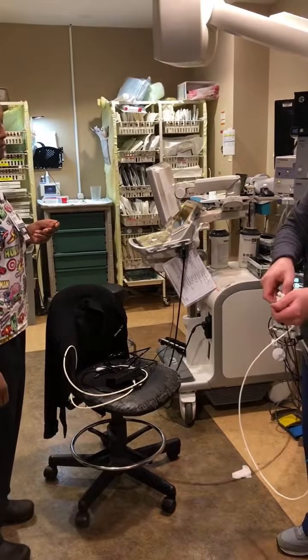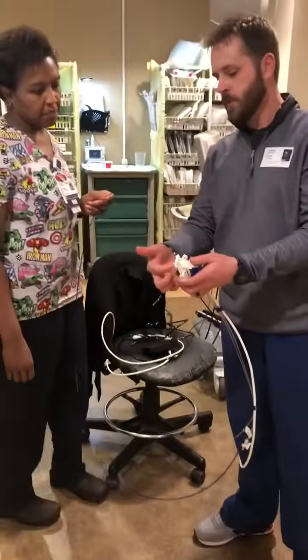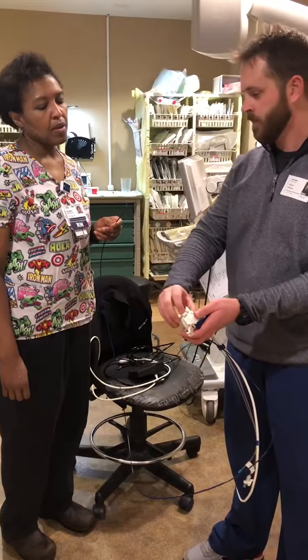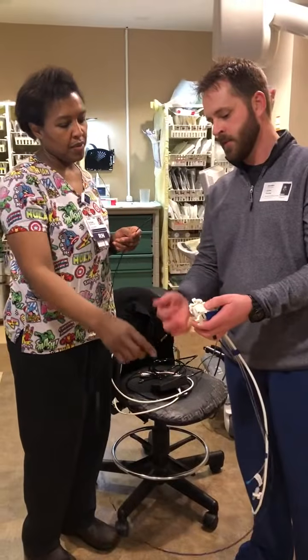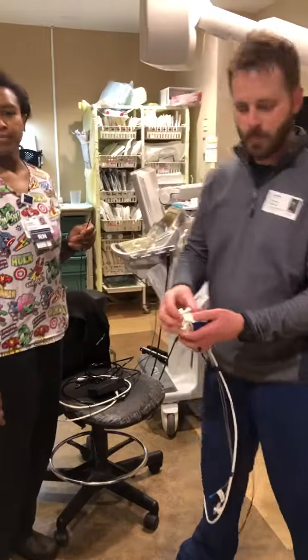Oh, yeah. This moves in every single direction. This, just like a normal ERCP scope, also has a lock. Okay. So you can lock these dials. So I can turn it and I can get it to stay at that angle. I can turn this. So left is locked, turn to the other. This right here is unlocked. Okay. This is locked for both dials. Okay. Alrighty.